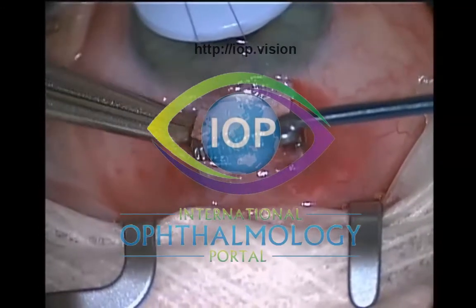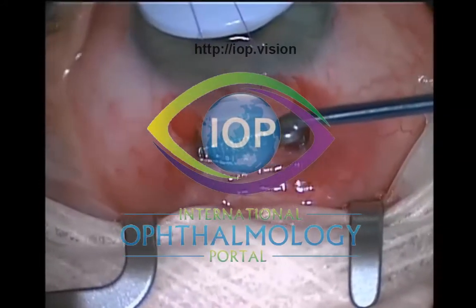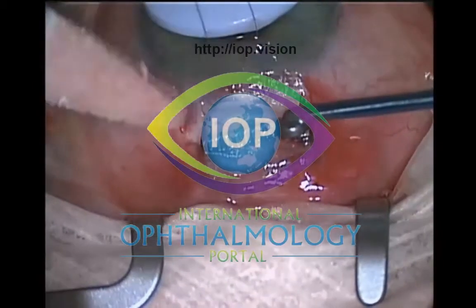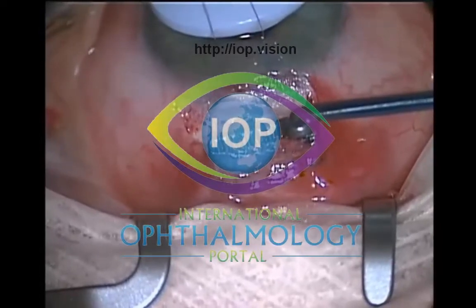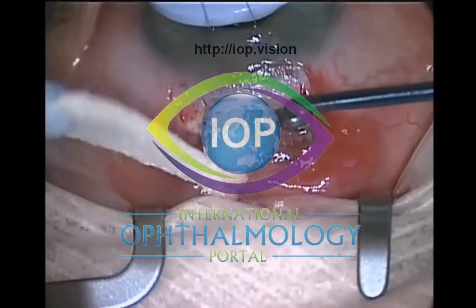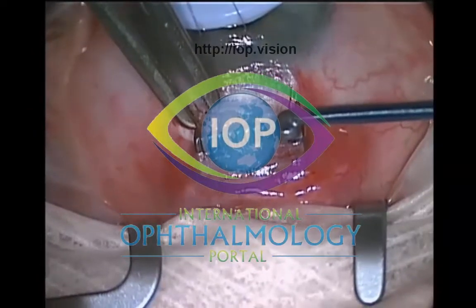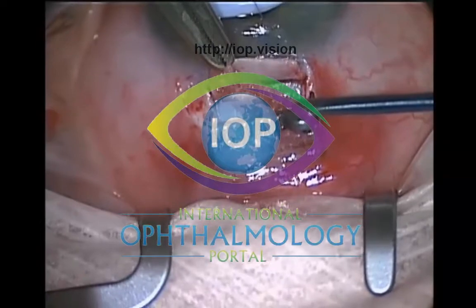And when I was using the clamp, I was finding post-operatively there were areas just along that conjunctival edge that had been crushed by the clamp and subsequently became avascular. So thinking about that, I designed this conjunctival retractor so that the conjunctiva is just draped over the retractor, so that there's no clamping, there's no crushing of the tissue.